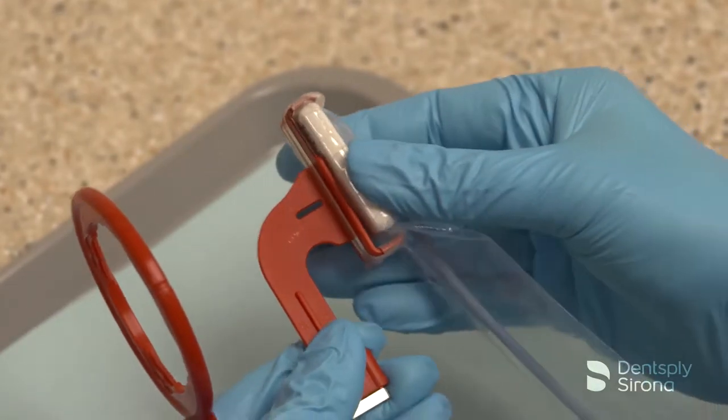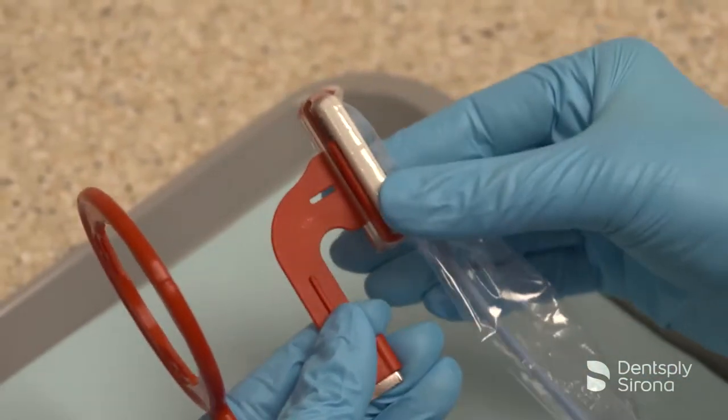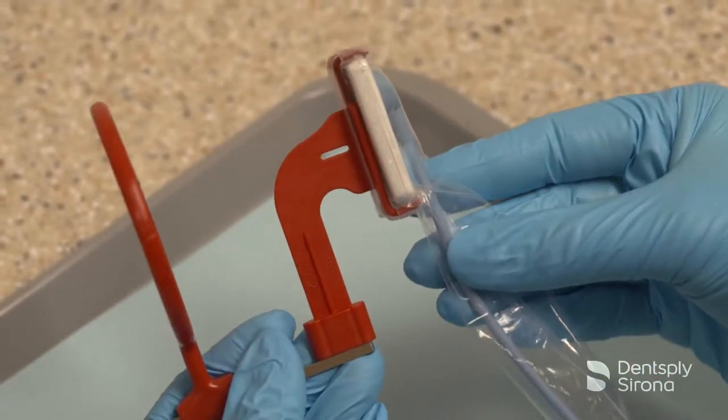Securely insert the sensor into the red bite block, making sure that the active side of the sensor is against the flat surface of the bite block.